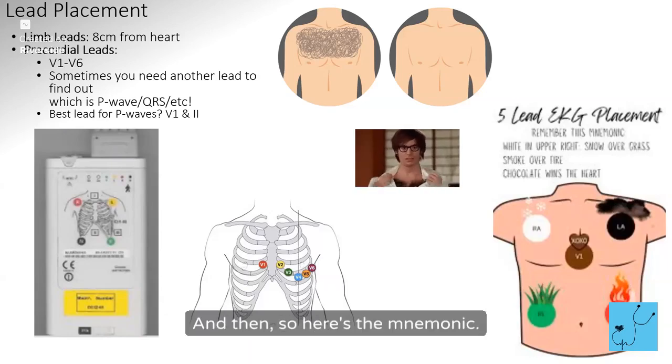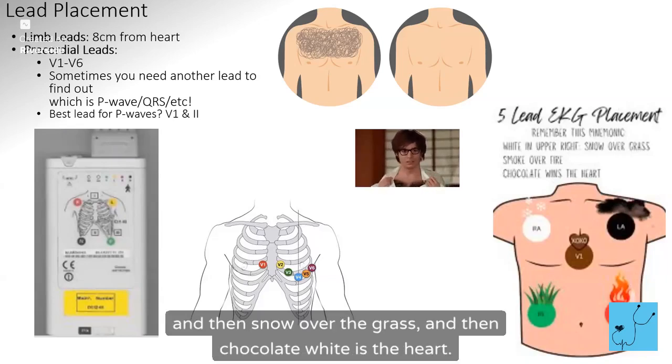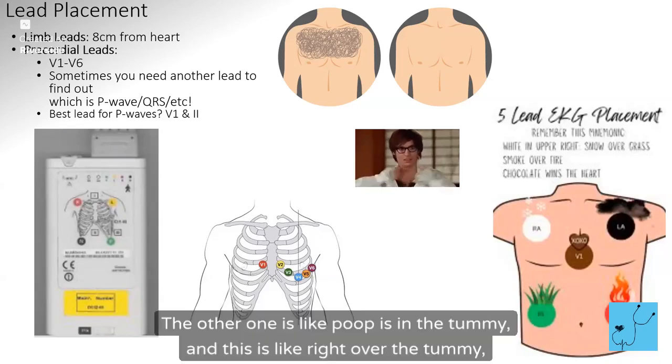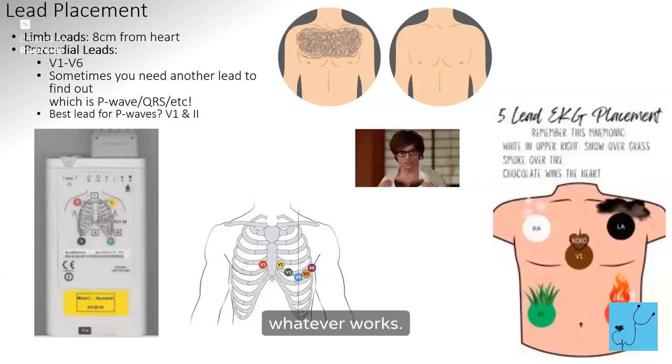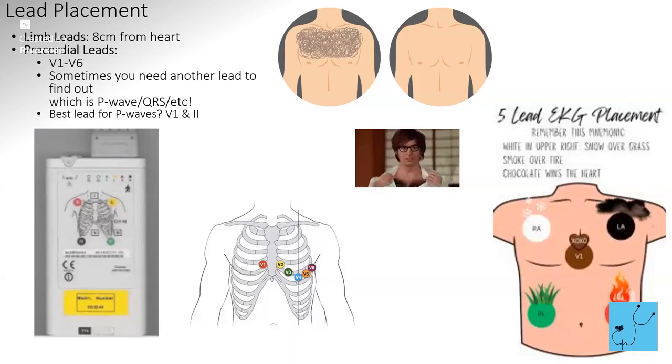So here's the mnemonic. We have white on the right, and then black is opposite white, and then smoke over fire, and then snow over the grass, and then chocolate wins the heart. There's a few different ones. The other one is poop is in the tummy, and this is right over the tummy. Whatever works. I like that chocolate wins the heart, but the poop one is probably one I remember more. So there you go.